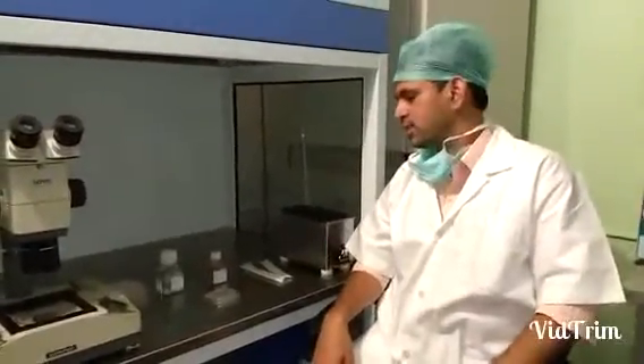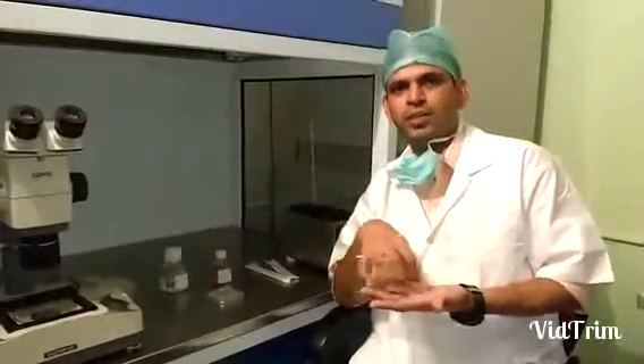Hello, in today's video I am going to show you how we prepare culture dishes. We prepare dishes well in advance, usually a day prior to the procedure, because we need to incubate the culture medium for at least 12 hours so that the medium is equilibrated to achieve optimal pH.